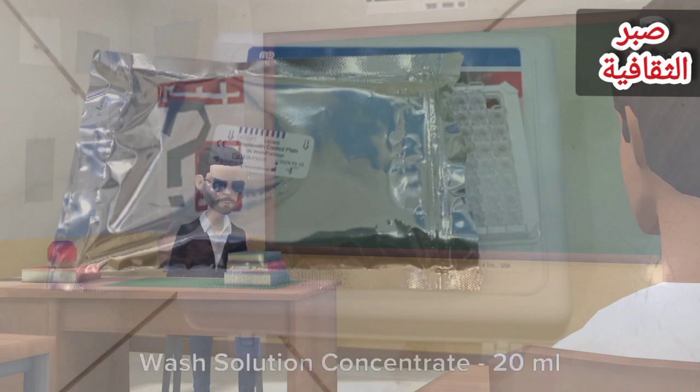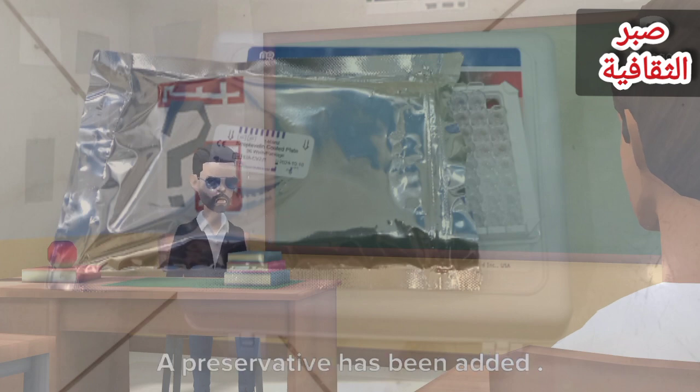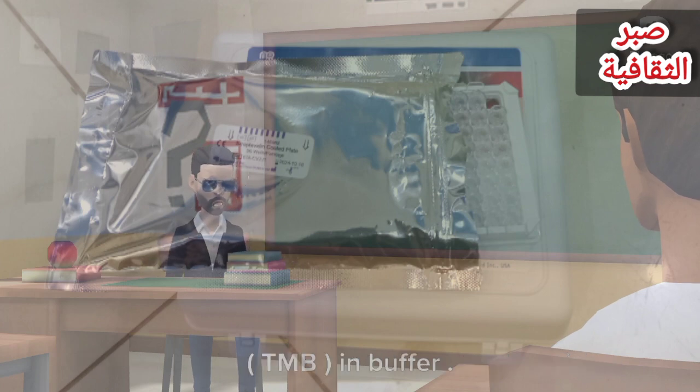D. Wash solution concentrate, 20 milliliters. Icon: one vial containing a surfactant in buffered saline. A preservative has been added. Store at 2-8 degrees C. E. Substrate A, 7 milliliters/vial. Icon SA: one vial containing tetramethylbenzidine (TMB) in buffer. Store at 2-8 degrees C.